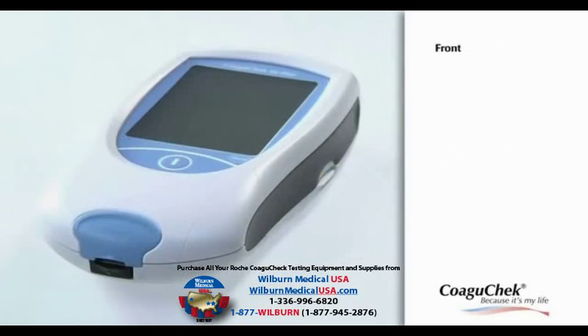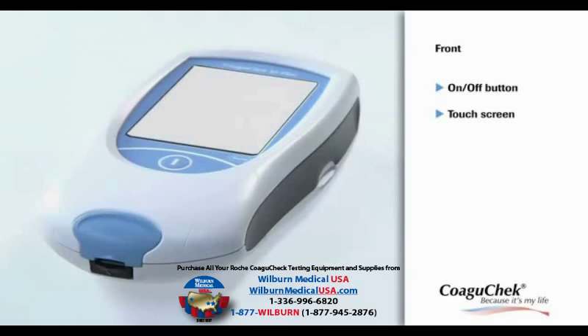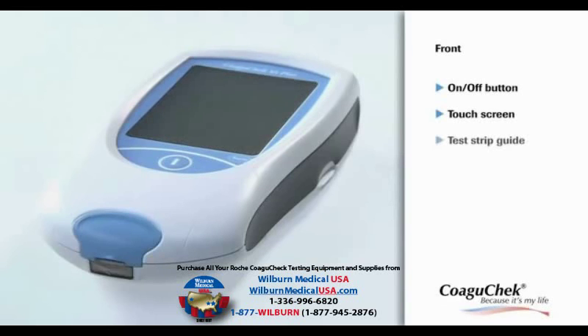Let's have a look at the front of the meter. Press the On-Off button to turn the meter on or off. The touch screen makes the meter very easy to operate. Test strips can be inserted into the test strip guide below the measurement chamber cover.